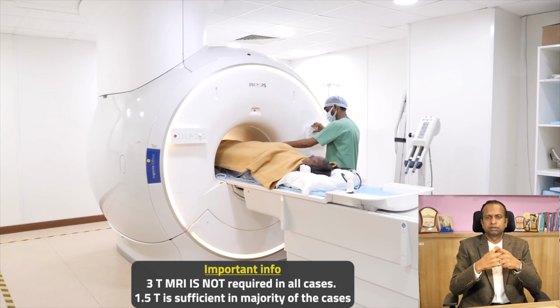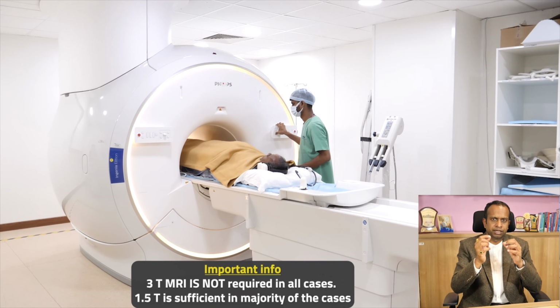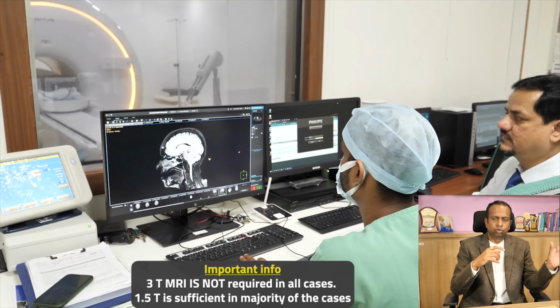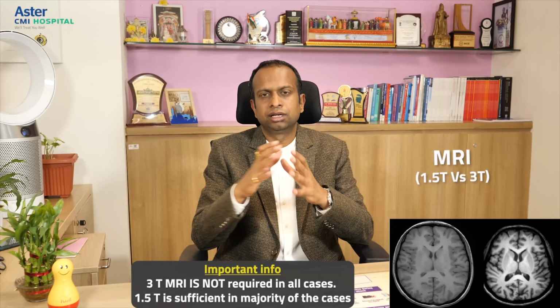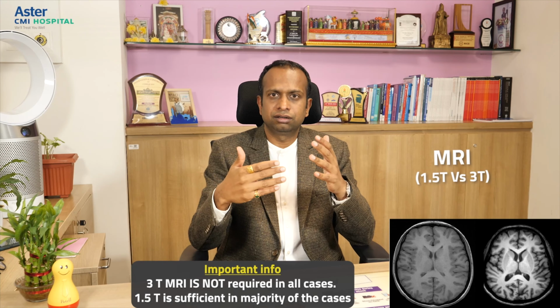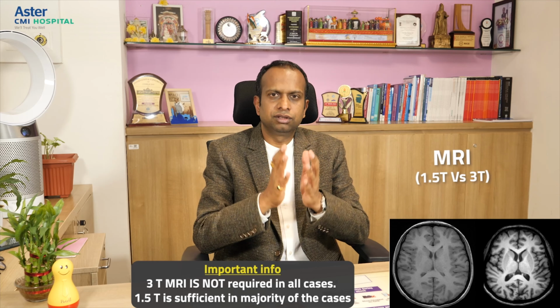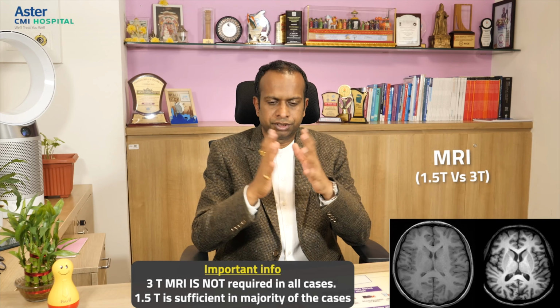The advantage of doing this, especially in some cases where we are looking for fine or very minor abnormalities, is that the clarity is huge. It's like comparing an old mobile phone from 10 years ago with the phone you have today. That is the difference in the clarity of the screen in your phones. That is the clarity of the images we get in a 3 Tesla. So this will be really helpful for you to get a good report and good information.